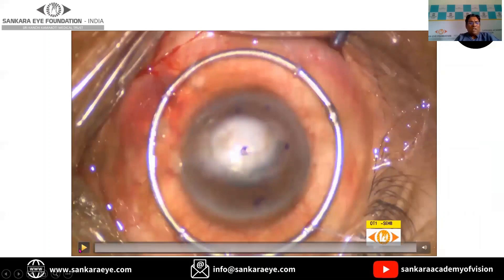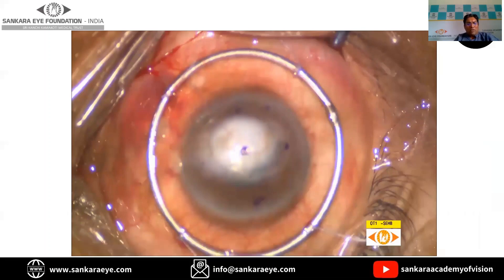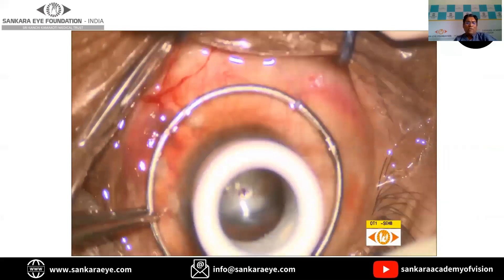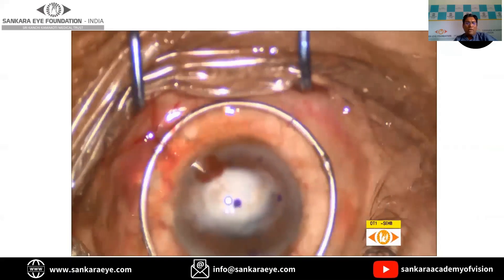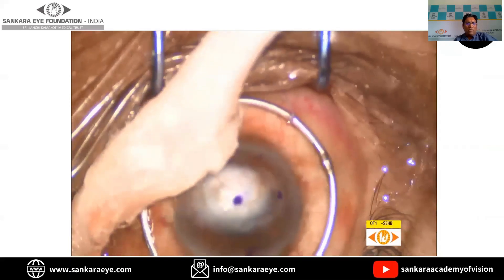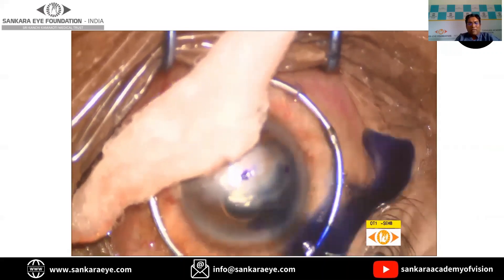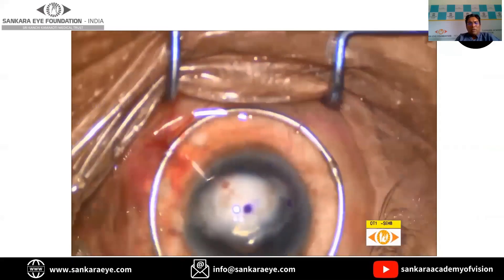Coming to the procedure, it is very important before starting to monitor and control the IOP. It is also important to measure the corneal information and, just before starting the surgery, to mark the geometric center of the eye so that the graft size can be centered around it. In this particular case, we are using a 7 mm trephine — the handheld trephine. It is very important to trephine in a very controlled fashion and not full thickness, as it might injure the underlying iris and the anterior lens capsule.